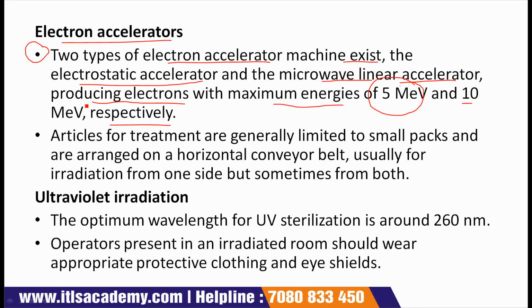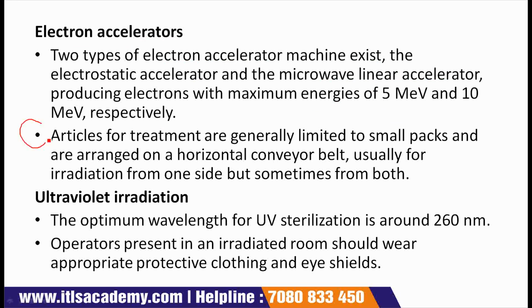Although higher energies would achieve better penetration into the product, there is a risk of induced radiation. Next point, articles for treatment are generally limited to small packs and are arranged on a horizontal conveyor belt, and it is usually for irradiation from one side but sometimes from both.